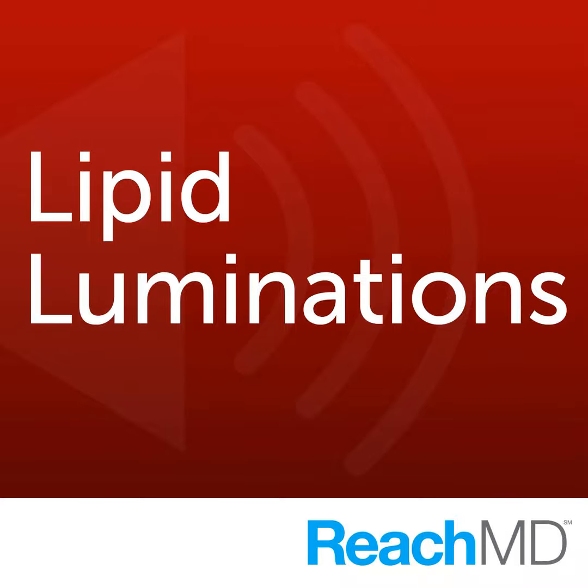Obviously, I'm biased because I'm a user and proponent of carotid IMT, but I certainly am in favor of some modality that actually looks at the vasculature, be it carotid IMT or coronary calcium, so that you're actually looking at the disease process rather than a marker of a risk factor that might lead to the disease process. So in that regard, even something as basic as total cholesterol is still looking at a risk factor. Carotid IMT and coronary calcium score are actually looking at the disease process.